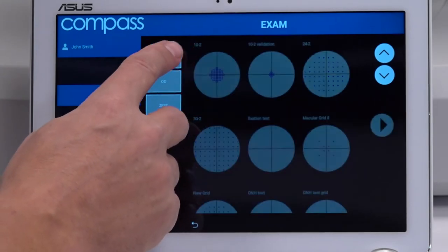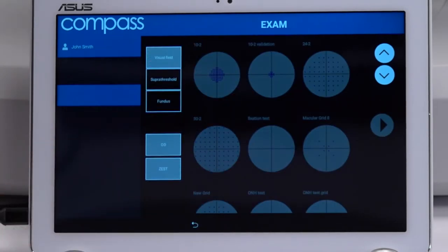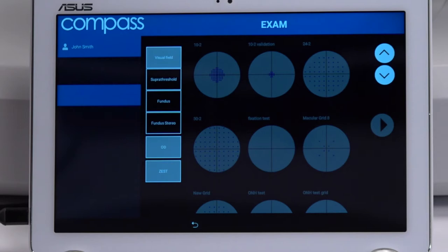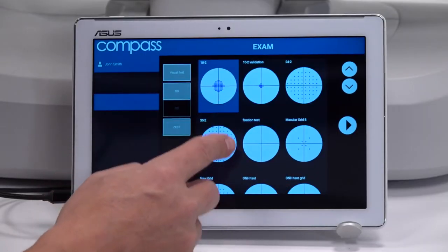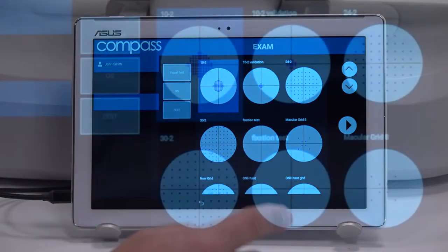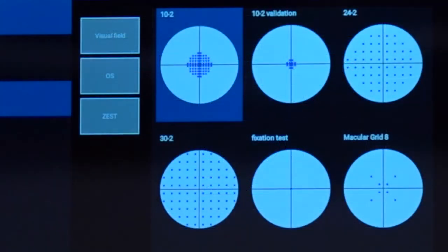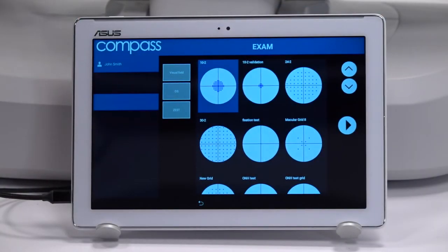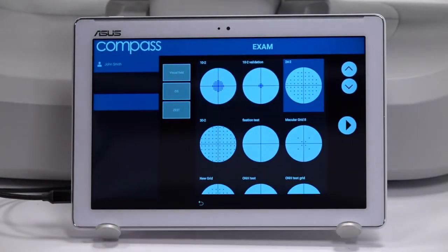The test options are Visual Field, Supra Threshold, Fundus, or Fundus Stereo. Select the eye to be tested — OD or OS — as well as the threshold strategy when selecting the visual field test. Select the exam pattern: 24-2, 30-2, or 10-2.